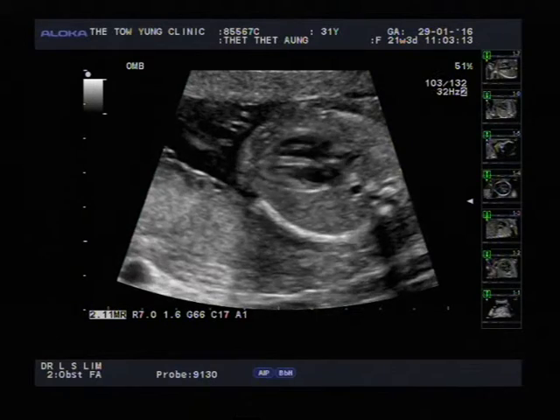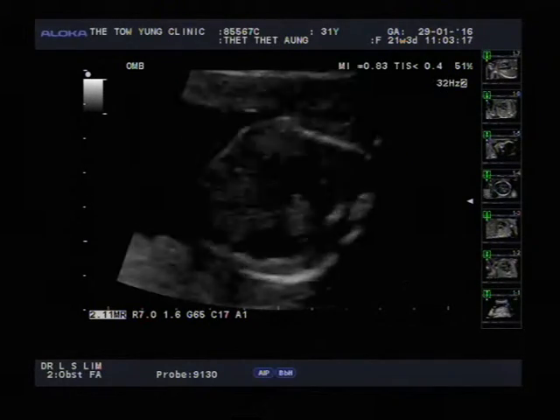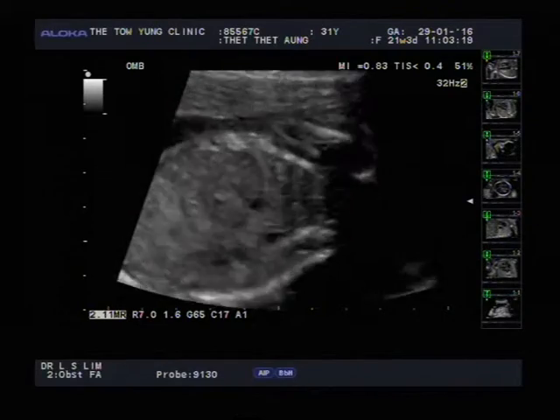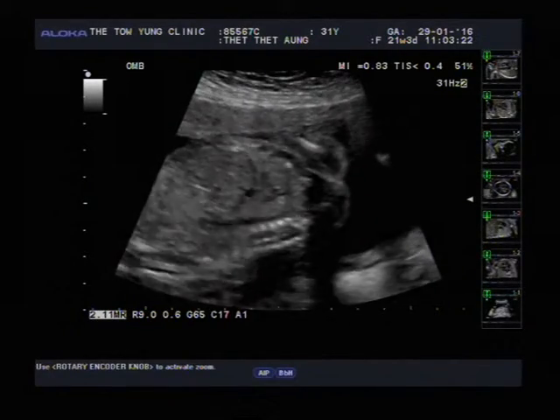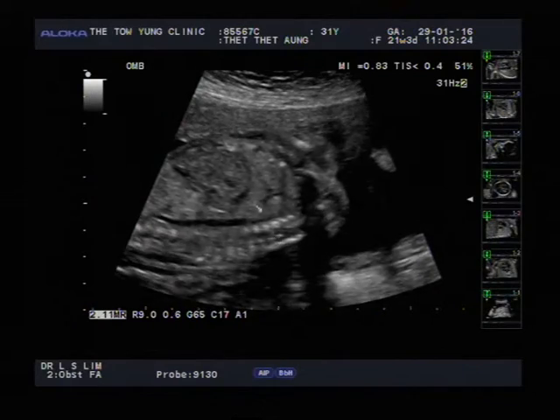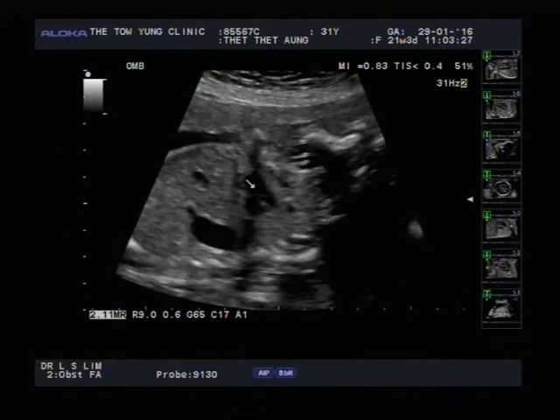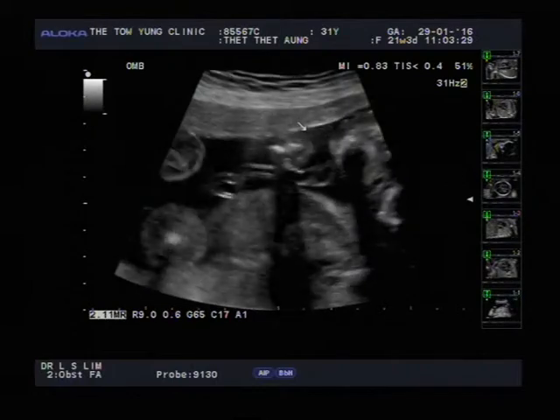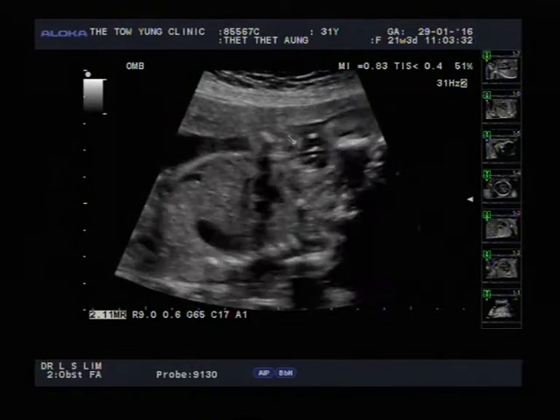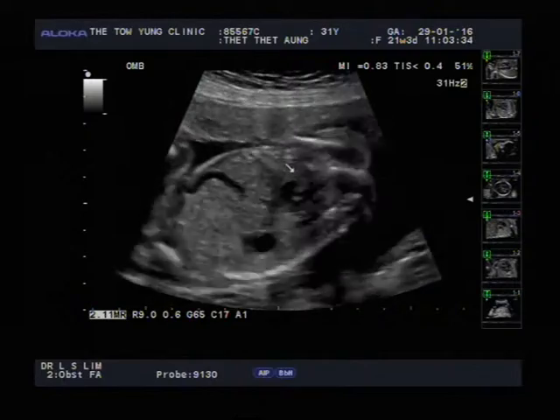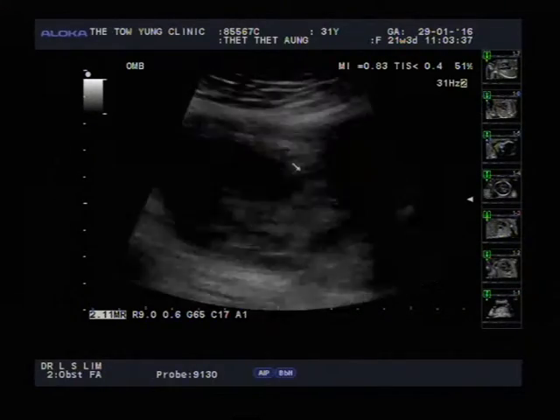You can see the movements of the heart in slow motion. The spine is at the back — there's the backbone — and the face of the baby is over here. Let's see whether I can get another look at the baby. We still haven't completed the brain — there are other parts of the baby's brain I need to see. Let's go for that now.